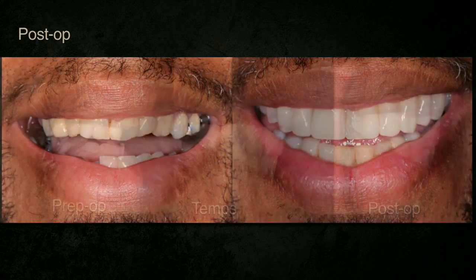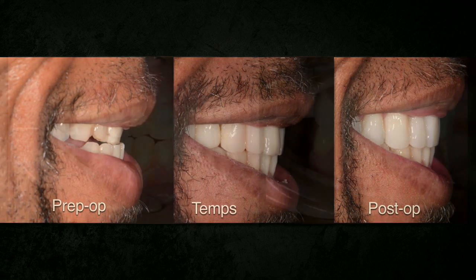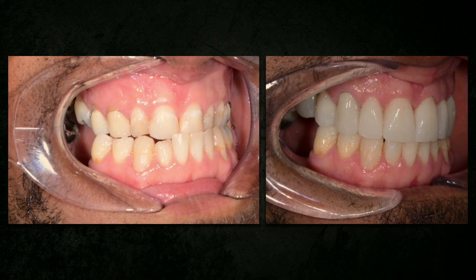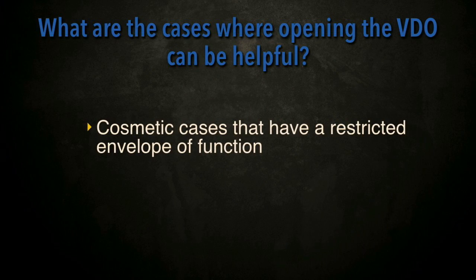And a nice result for him. Okay, moving through like that. Again, getting set up for having one second molar removed and then some implants placed on the bottom. Let's look at one more and we'll take a few questions.